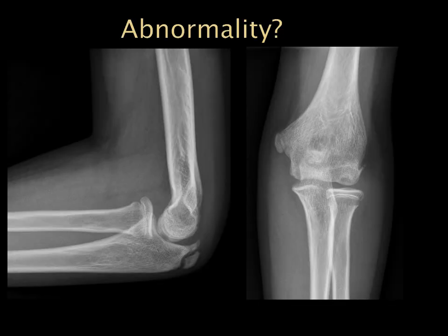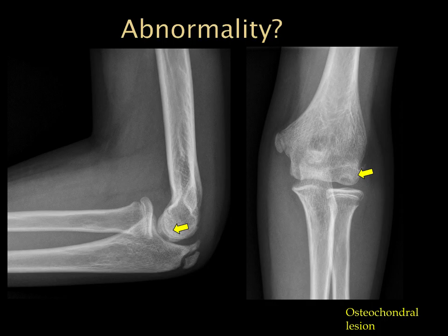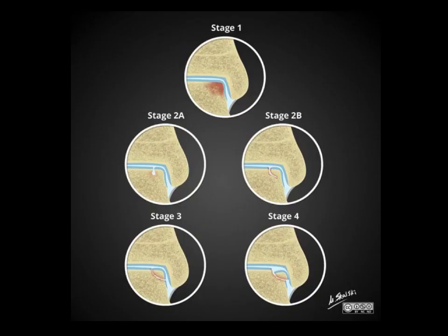On this lateral and frontal view of the elbow, we have an osteochondral lesion. It might be more subtle on the lateral but we see it well on the frontal view. These osteochondral lesions can be graded differently according to different systems.